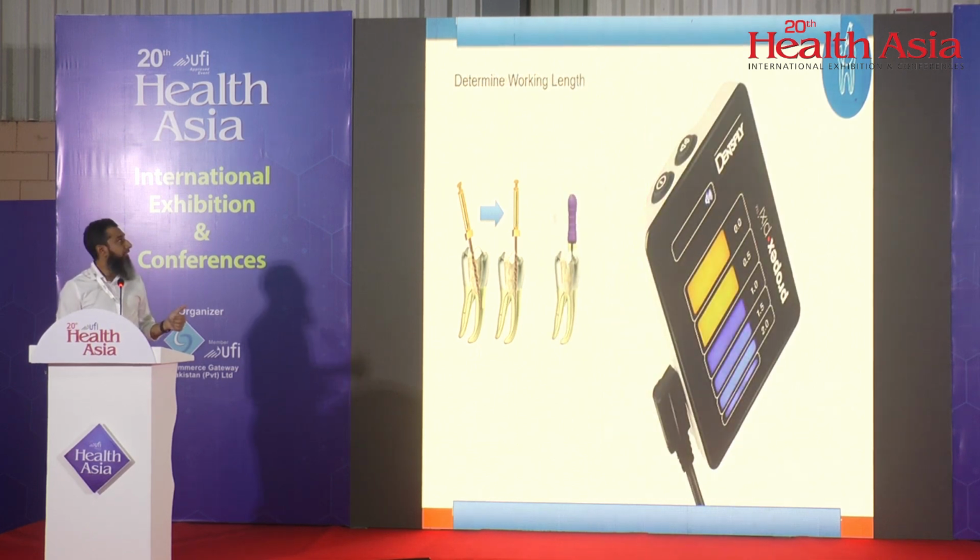Your working length needs to be accurately determined. For that, you can have a radiograph as well as your apex locator. Because one other objective of root canal treatment is that your apical stop should be at the correct position. If your files have gone beyond the apex, that means you have created an open apex, and now the bacteria or everything which is inside the canal will go into the periapical area and will result in periapical inflammation and could ultimately jeopardize the long-term result of root canal treatment.